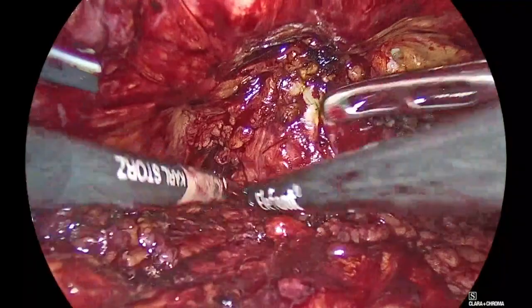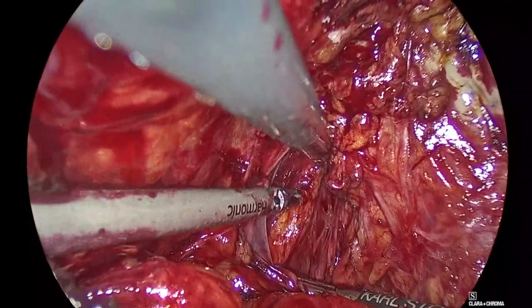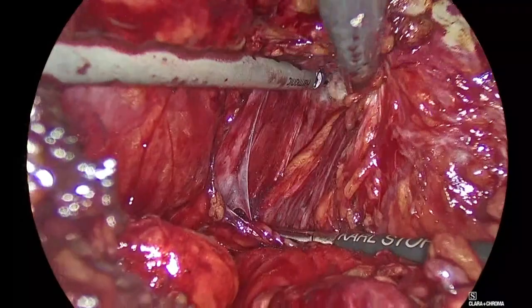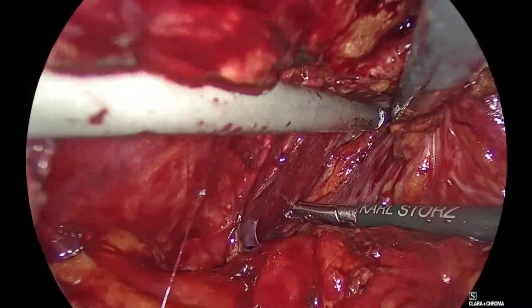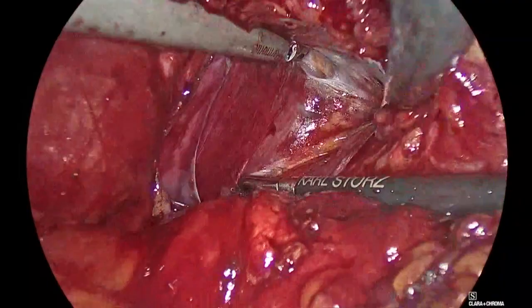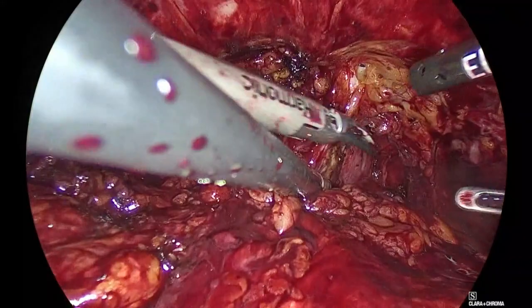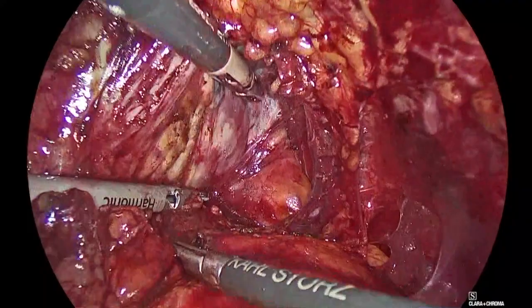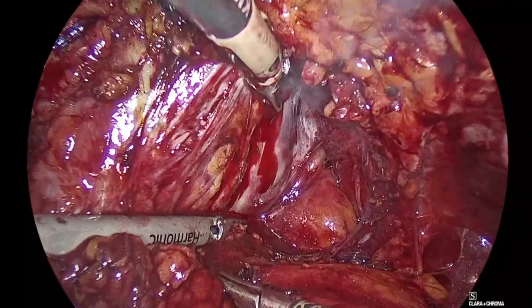Okay. So this is left side and the pelvic fascia again. As I told you, I have some issues with my left instrument. You see that what I do here is I kind of dissect the endopelvic, go further up. Good. I kind of dissect then the pelvic fascia until I can. Good. Go back. Good. Not so much. Right side. And I will leave the rest probably for later on. Dissection here, blunt dissection. As you see, there's some nice vessels there. Good.